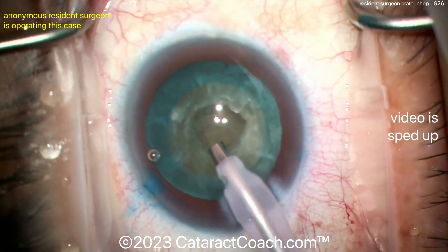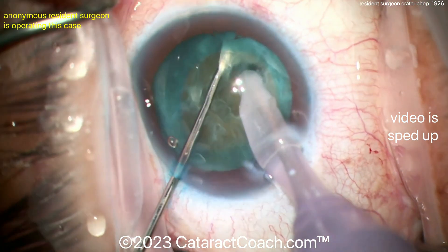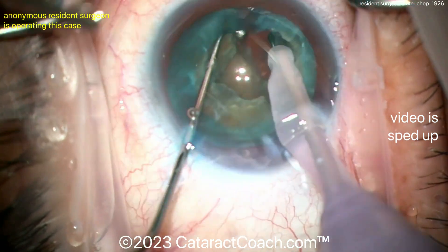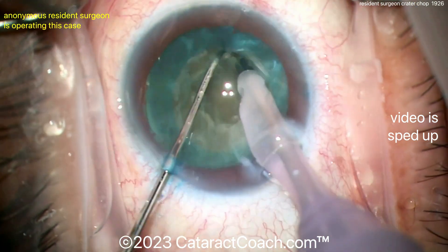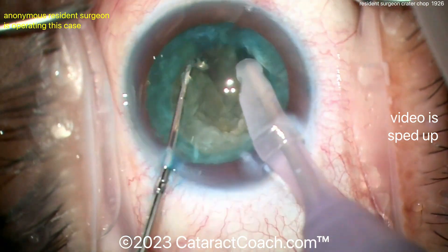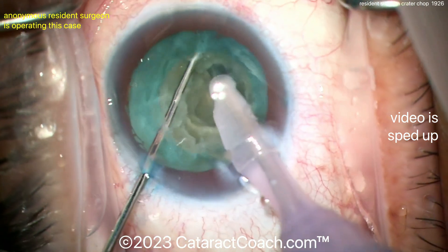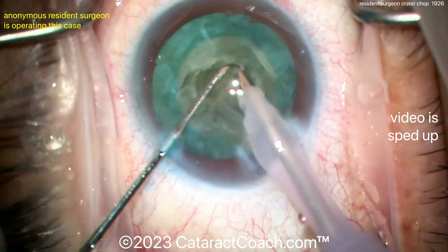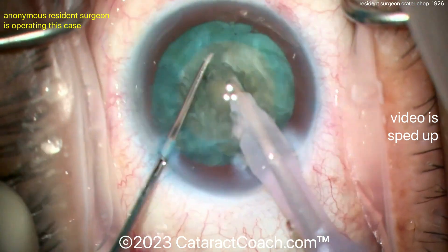Here comes the ball-tip chopper for horizontal chop going around the lens equator. You don't even need vacuum to hold the nucleus — you just position the nuclear piece between the probe and the chopper. So if you don't want that time constraint of buzzing in with the phaco probe and only having a second or two before losing vacuum to get the chop done, try a crater chop. We've featured this on CataractCoach before and there are other variations as well.